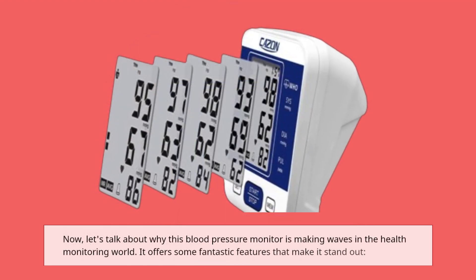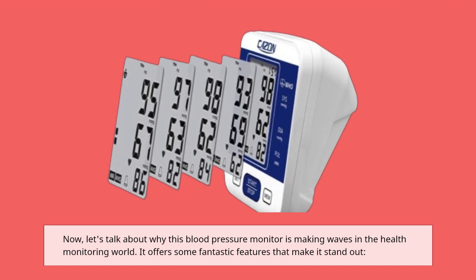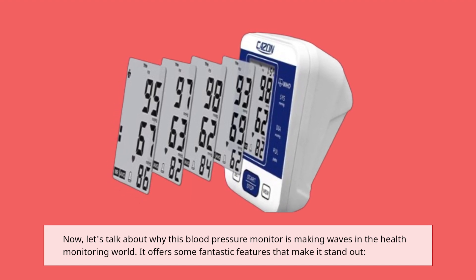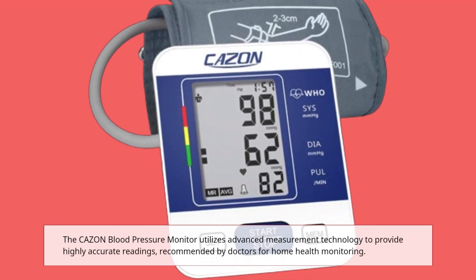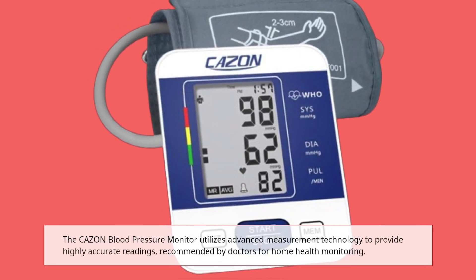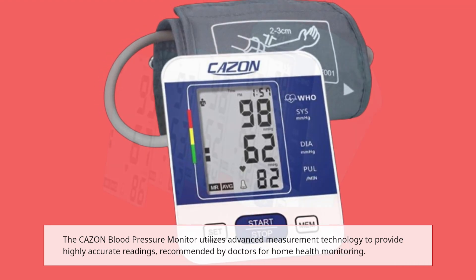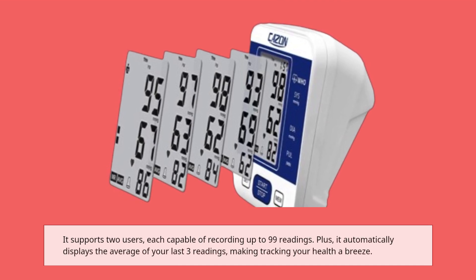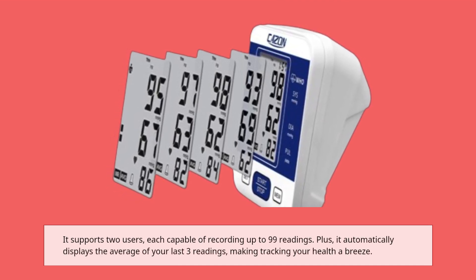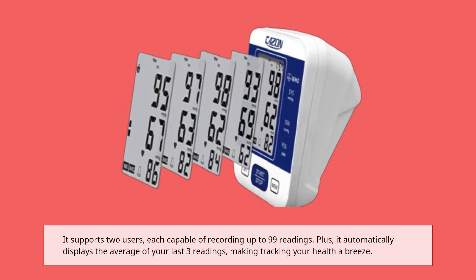Let's talk about why this blood pressure monitor is making waves in the health monitoring world. It offers some fantastic features that make it stand out. The CAZON blood pressure monitor utilizes advanced measurement technology to provide highly accurate readings, recommended by doctors for home health monitoring. It supports two users, each capable of recording up to 99 readings, and it automatically displays the average of your last three readings, making tracking your health a breeze.